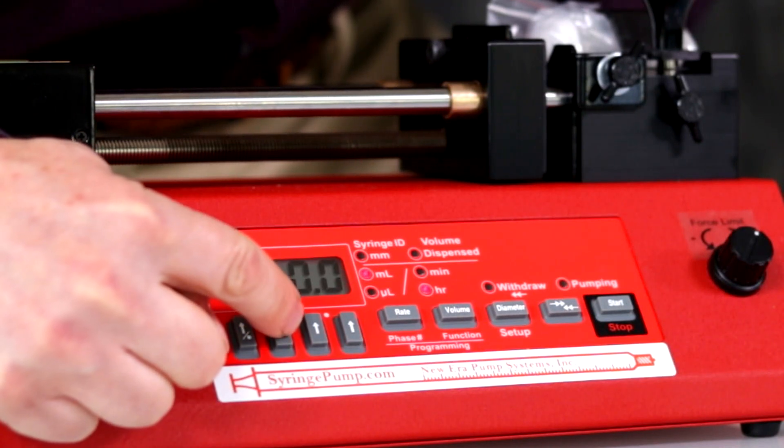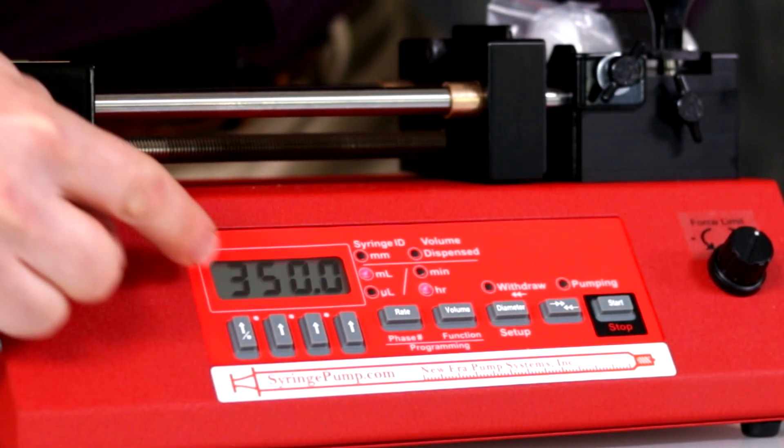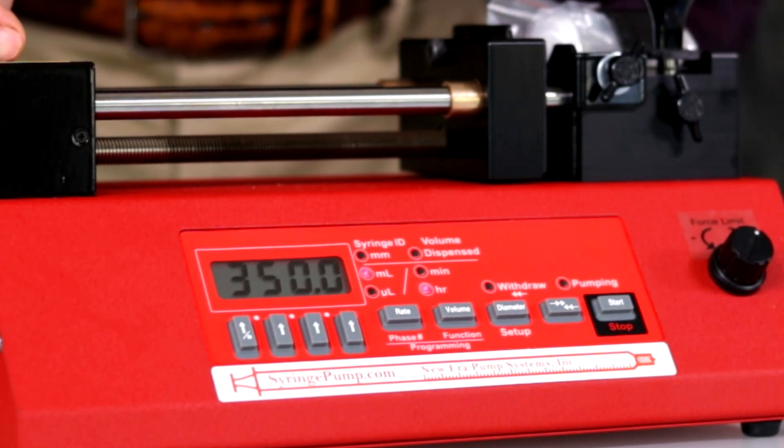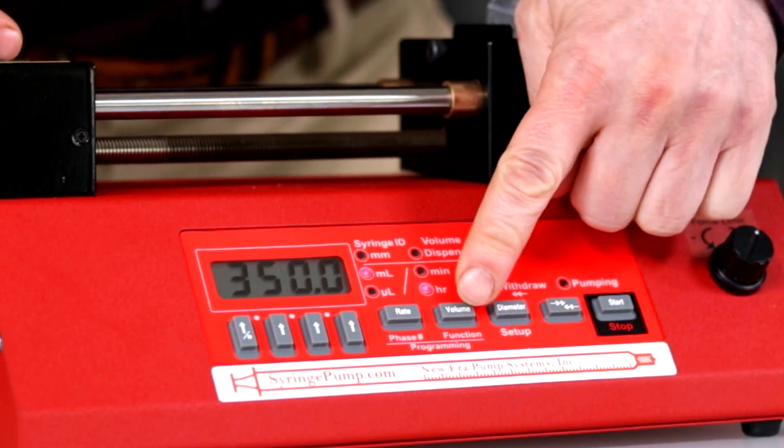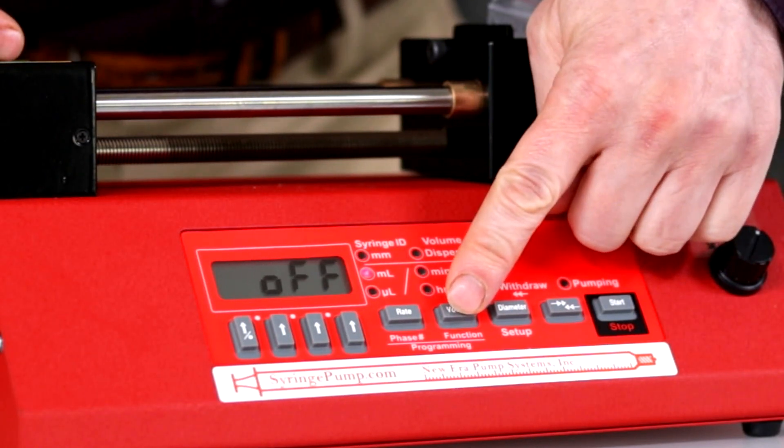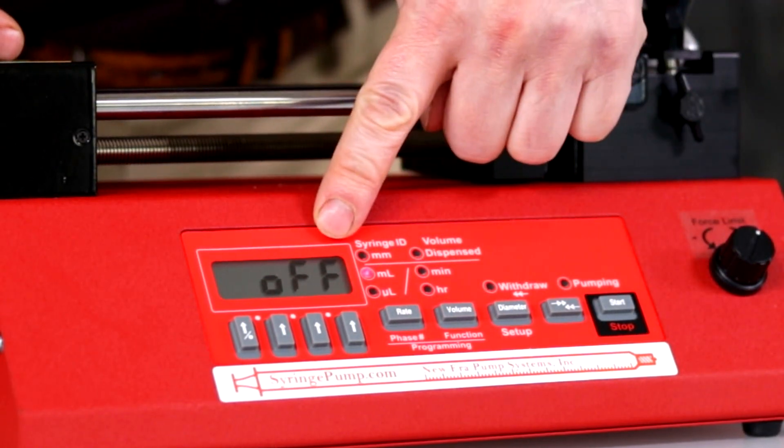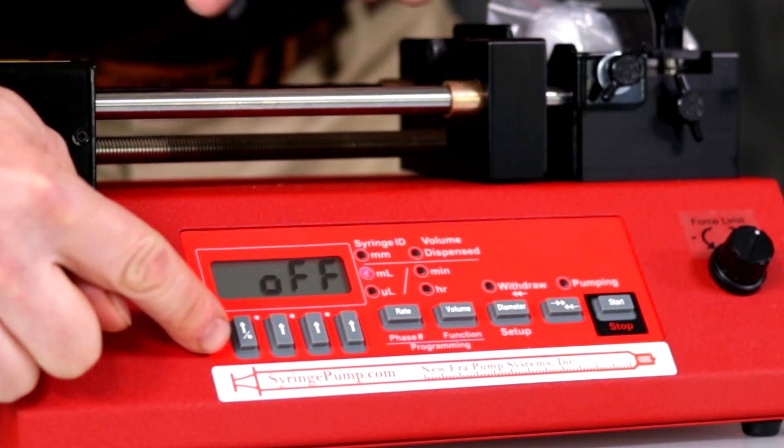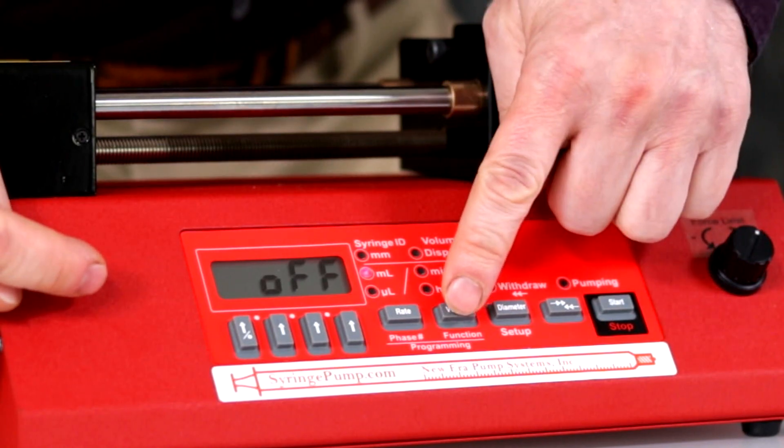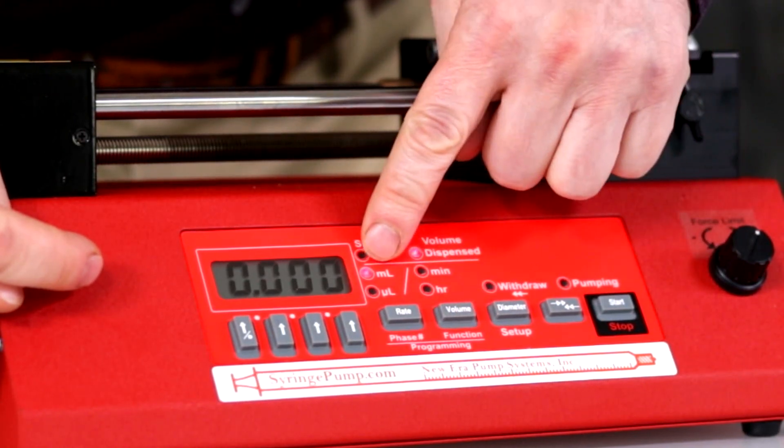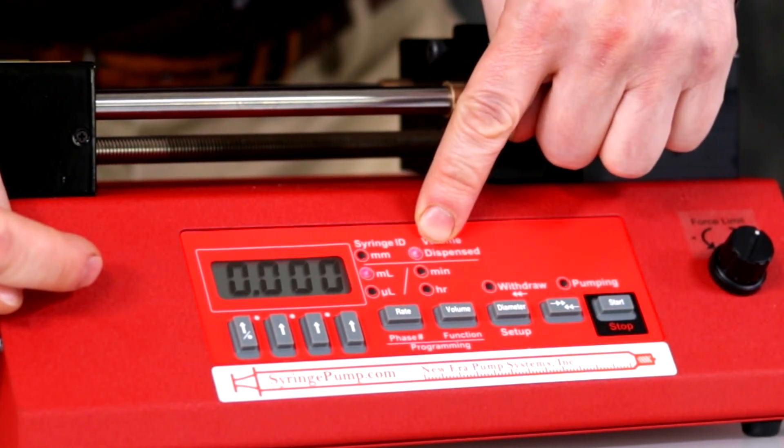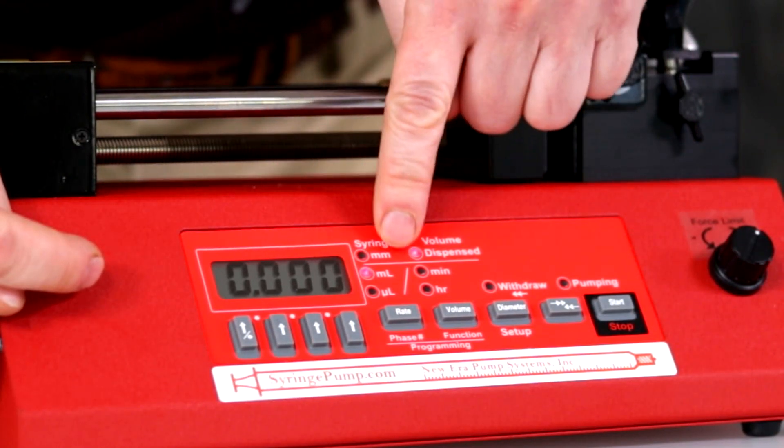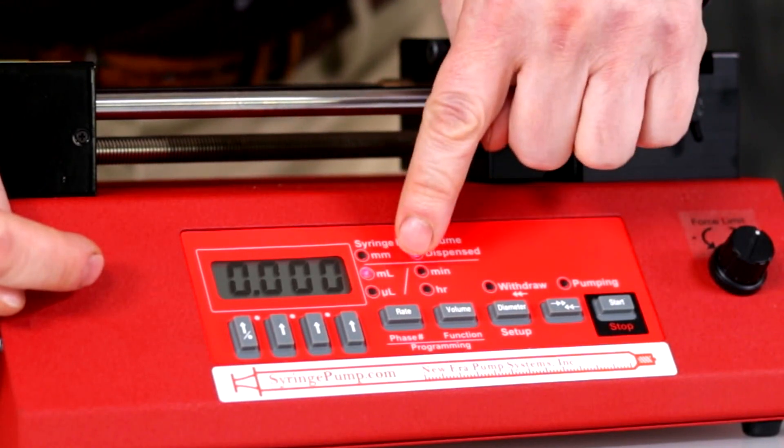Press the volume key to show the volume target off, indicating continuous pumping. Press the volume key to set a volume target. Pressing the volume key again shows the volume dispensed, which is zero. You can change the units used by the pump from milliliters to microliters. We will pump in milliliters with continuous pumping off.